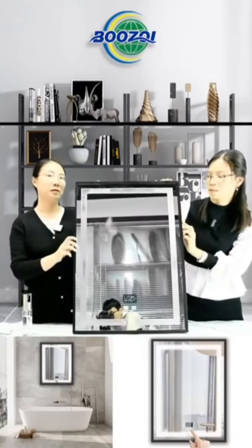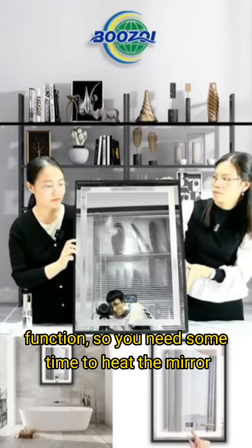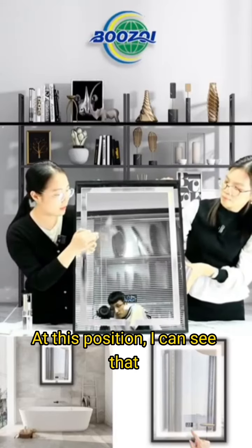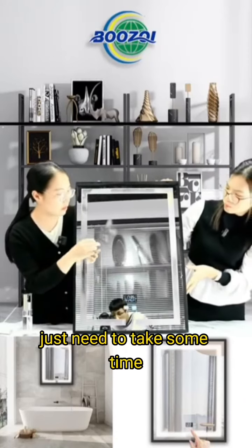We could just turn on the function. So you need some time to heat the mirror. Actually, in this position, I can see that. It becomes much clearer. It's getting dry. Just need to take some time.